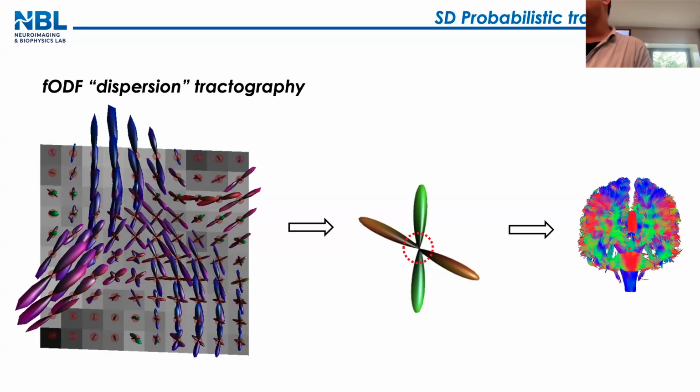If you read the chapter on probabilistic tractography in the book we published, we introduce a new way of classifying probabilistic algorithms. There is what we call dispersion tractography and real probabilistic tractography. The real probabilistic tractography is the one from, I don't know, BedpostX, FSL. Some people in San Francisco use Q-ball with residual bootstrapping. So the idea is to use noise to see what is the uncertainty. But if you use spherical deconvolution and you use MRtrix or StarTrack, you can actually use the shape of the FOD as anatomical information of the track dispersion.